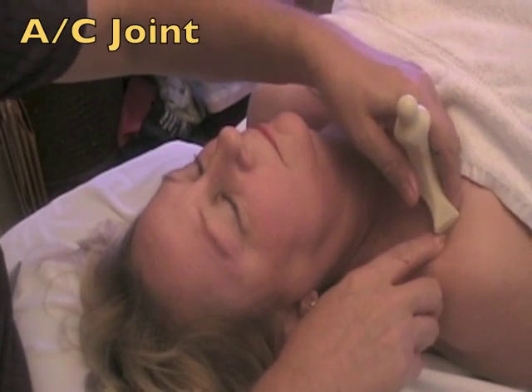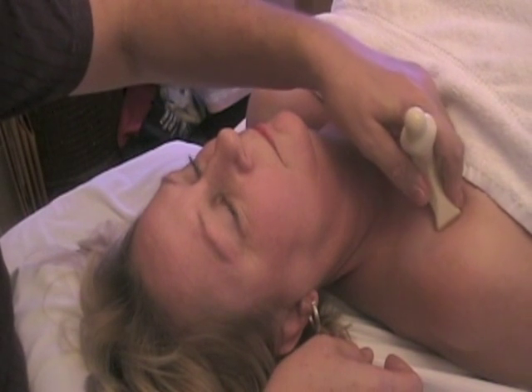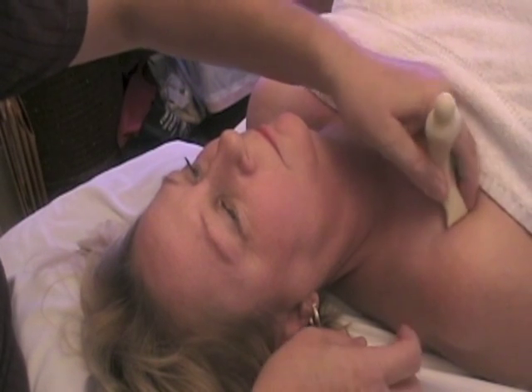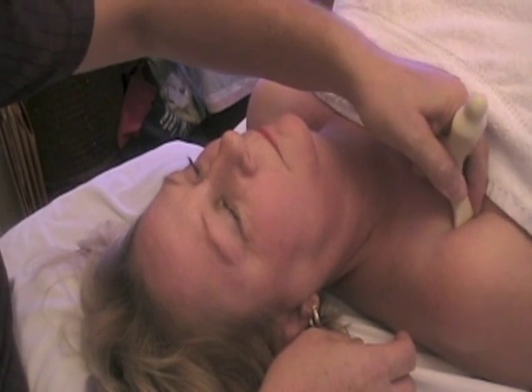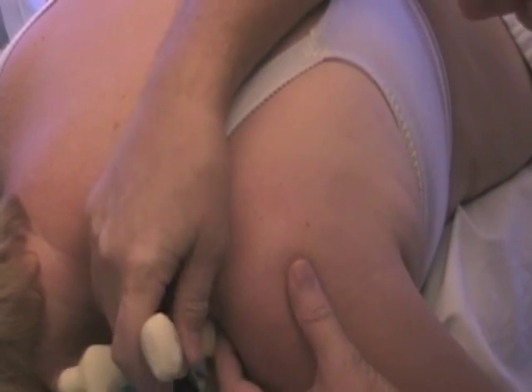Here I am treating the AC joint. You'll never get your fingers in between those bones. This little tool is just fantastic for getting in between osseous areas — bone areas everywhere in the body. Remember, the more precise the treatment, the more thorough the results. You can also treat the AC joint with the person face down.